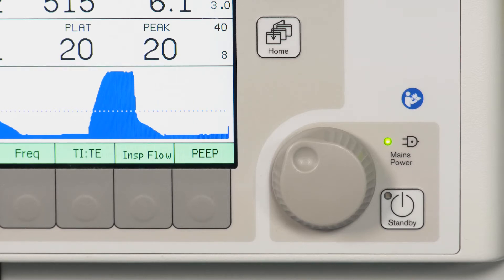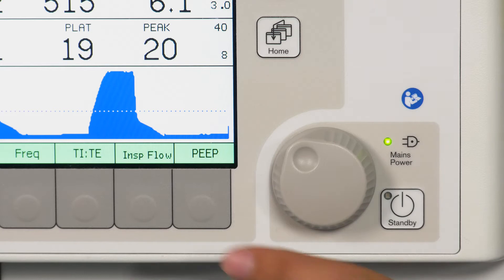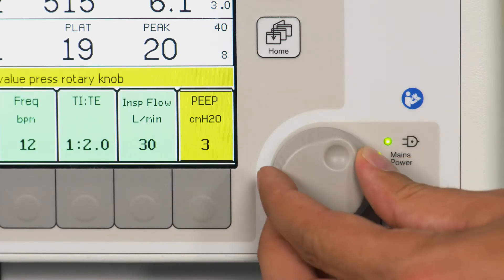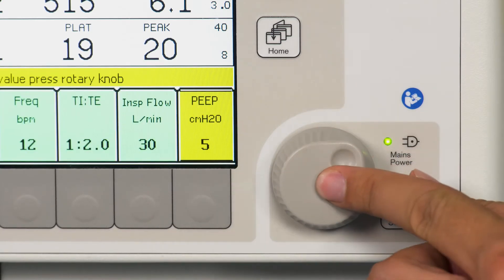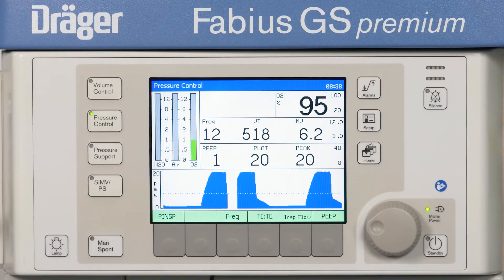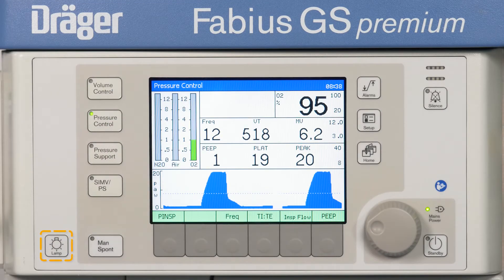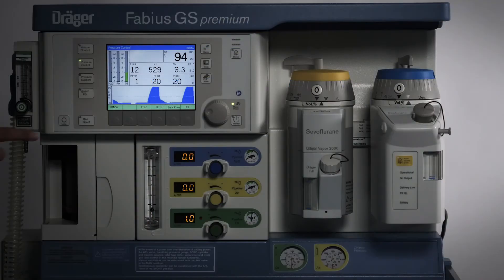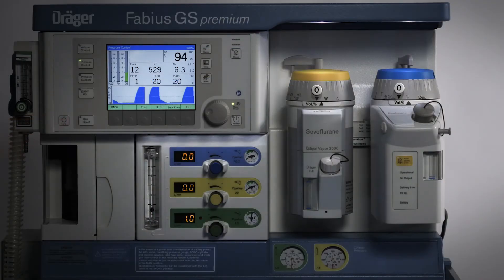The operating philosophy is simple: select a setting, turn the rotary knob to change the setting, and confirm the setting by pressing. The key for illuminating the vaporizers and the fresh gas control valves is also located on the control panel. This eases working in dark environments.